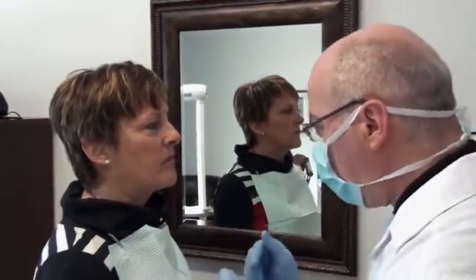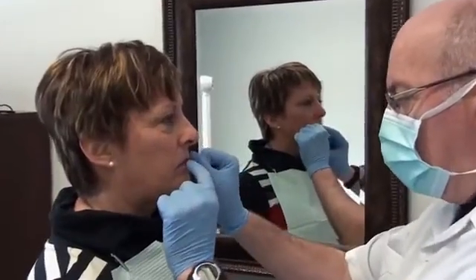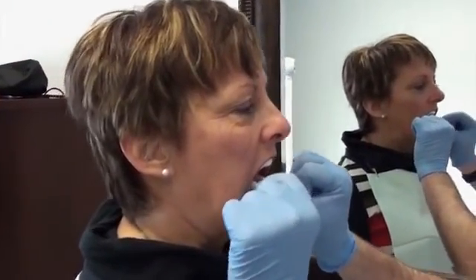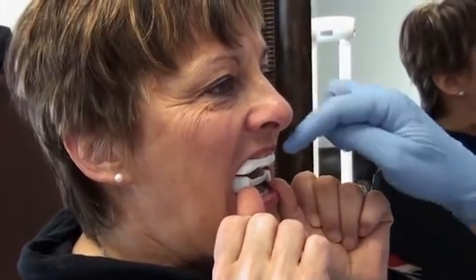To the patient: in order to remove the device, you will place the nails of your thumbs under each lower shell, in parallel to your teeth. You will slowly lift up the appliance on the left side and on the right side while opening your mouth. Put your index fingers on the shells in order to remove the device.